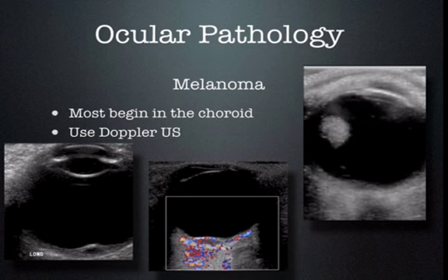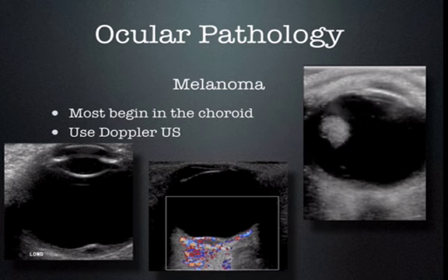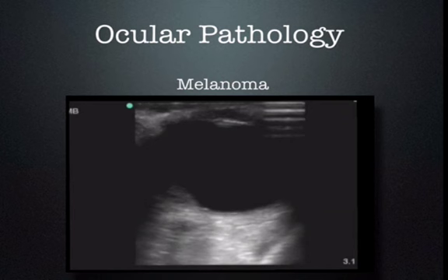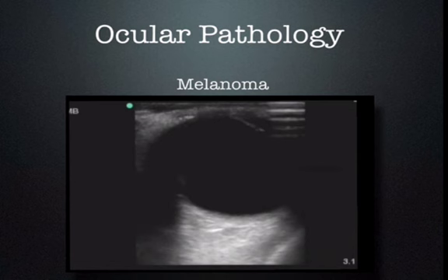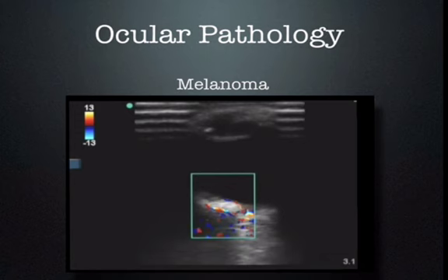You will run into melanoma on occasion. Melanoma will appear as a hypoechoic structure, generally in the choroid or at least beginning in the choroid. It may become pedunculated and hang into the vitreous. If you put on Doppler, you can see the blood flow around it because it's in the choroid — which has the blood supply of the retina. It can be a little challenging to see if very smooth or flat, but look for bumps and turn on Doppler to see if there's blood flow. If it's not in a TB endemic area, it's more than likely a melanoma. Here we can see a lesion that started in the choroid and is extending into the vitreous — with color Doppler, we can see the blood flow around it confirming this is an intraocular melanoma.